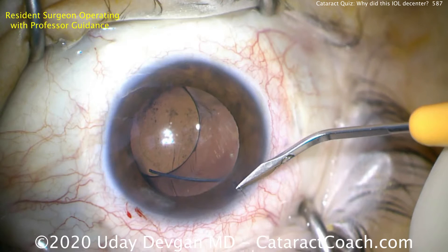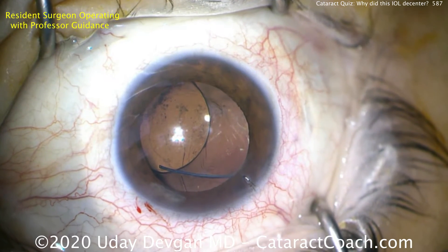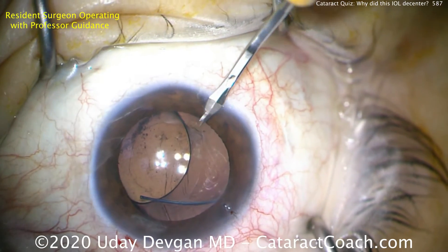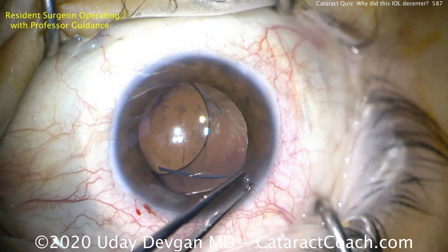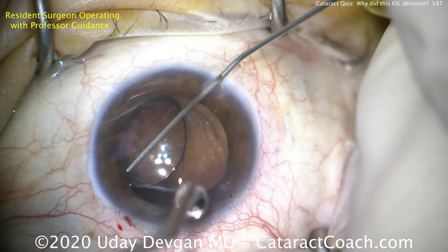The capsular bag is totally intact. So let's take out that suture there and open up this original incision. The patient had cataract surgery combined with a vitrectomy about two months ago. Initially the IOL was reasonably centered, but as the eye healed and the capsular bag contracted, this lens de-centered.